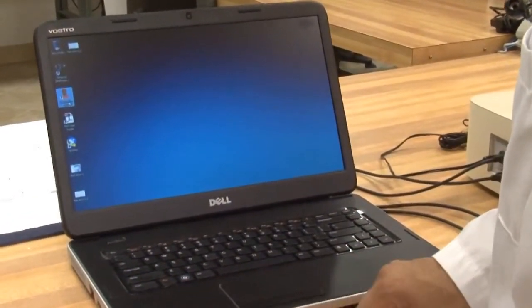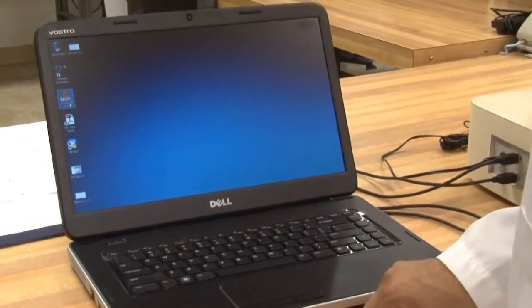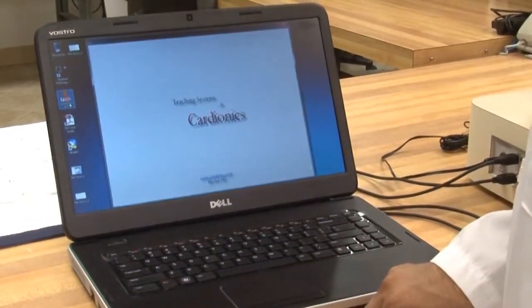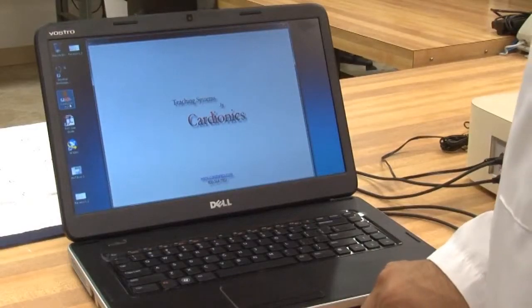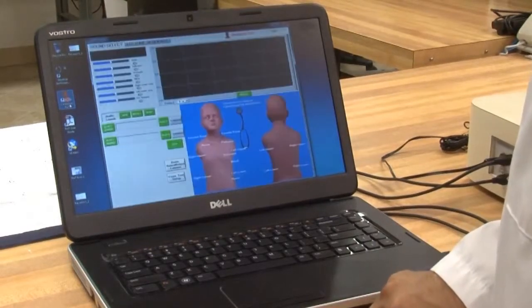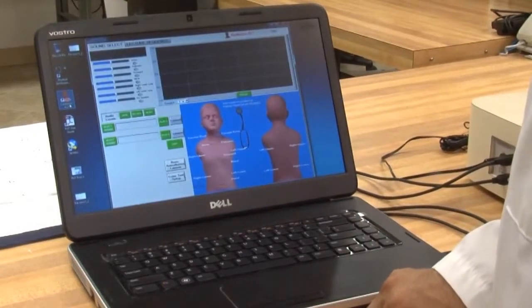To access the PAP software control interface, double-click the Cardionics PAP icon on the main desktop.